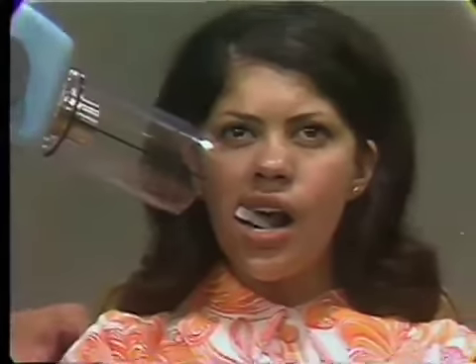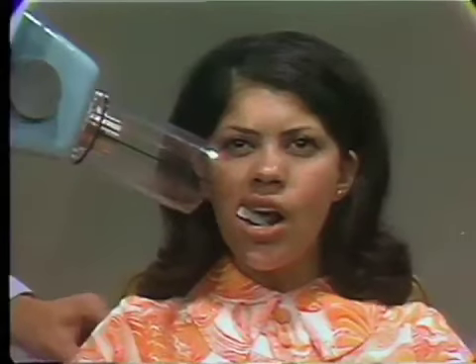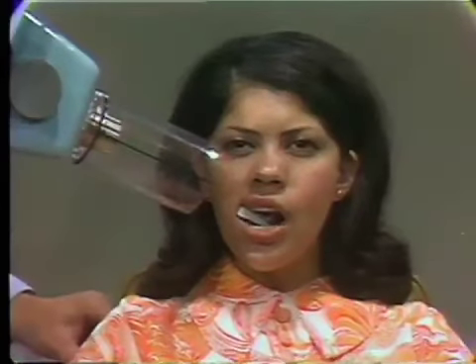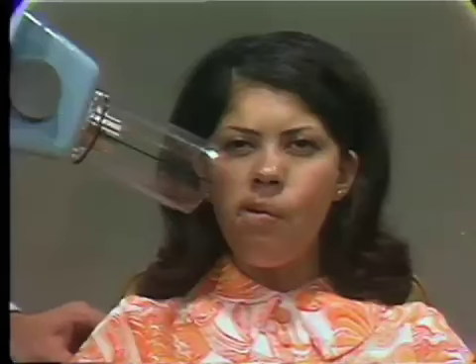Now, the next step, rather, the fifth step, is to make the exposure. But before the exposure is done, we'll ask her to close her lips. So then the exposure is completed, the machine drawn aside, and the film and block removed.